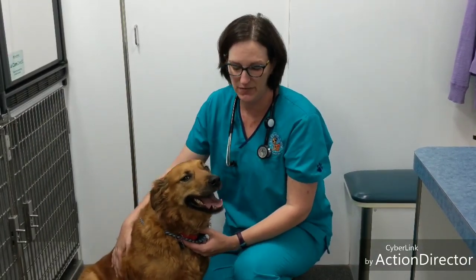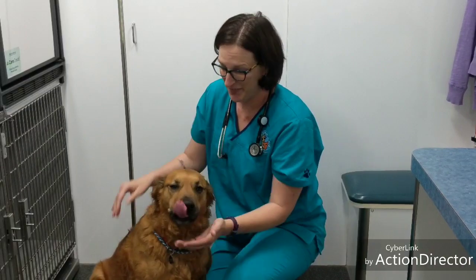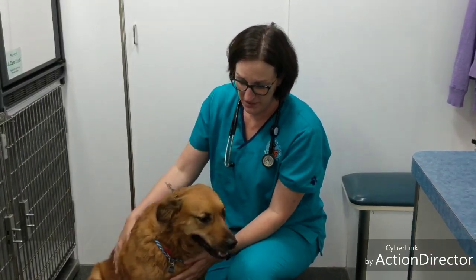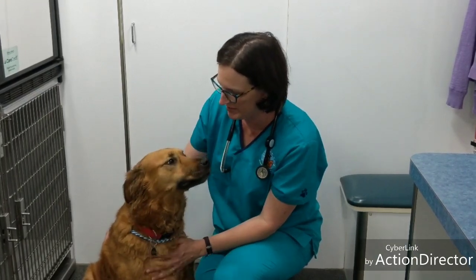Today our patient is Annie. Annie is a 5-year-old golden retriever mix, and she is here for her second professional dental cleaning. So the first thing we always do is get her weight, and we already verified that. And now we're going to do her physical exam, make sure her heart and lungs sound good, and everything's ready to go for her anesthesia so she can have her dental cleaning.